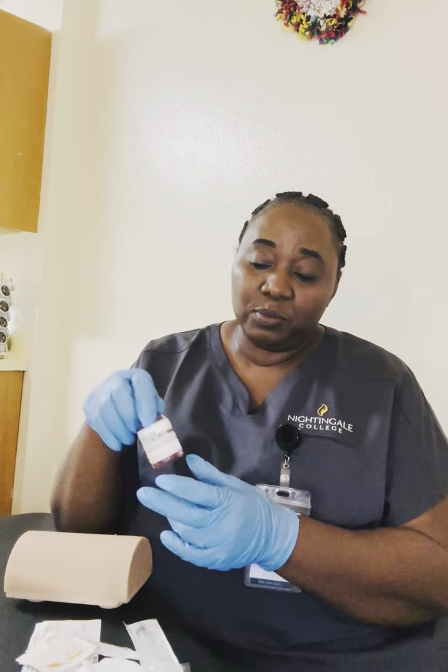Once I've worn my glove, I'm going to take my supply. I'm going to go back to the EHR and the cart to take out the medication. The order is for morphine injection. I'm taking out the morphine. What I have in hand is 4 milligram per ml. The injection has not expired.